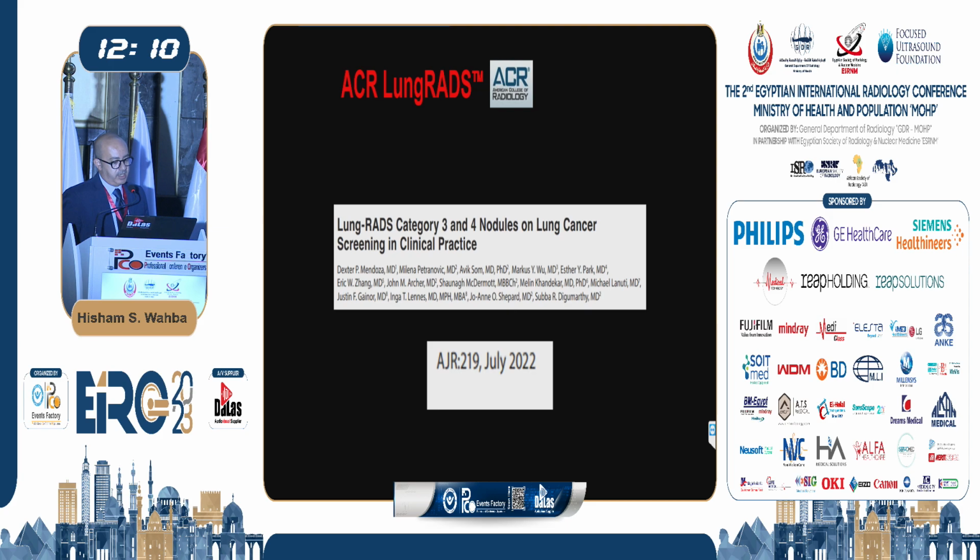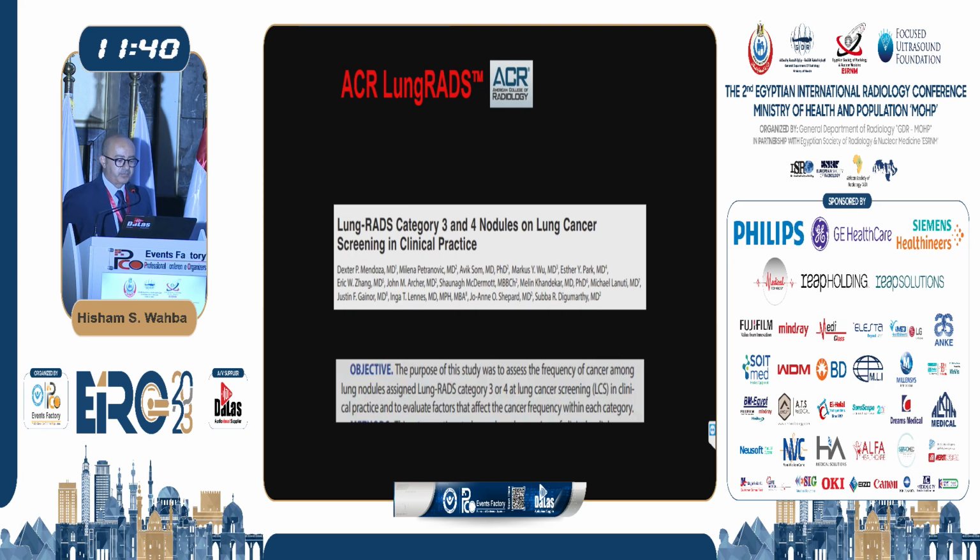Another study came later on and was published in AJR in 2022, and they were focusing on Lung-RADS 3 and 4, and these are the categories where there are debates because they cost each country a large amount of money because an action should be taken, whether a further CT examination or other modalities like PET-CT, biopsy, or bronchoscopy. So these are the nodules where we should be taking care when we report Lung-RADS 3 or 4. The purpose of the study was mainly to assess the frequency of cancer in those categories, whether whenever we call Lung-RADS 3 or 4, this is a real cancer or not.